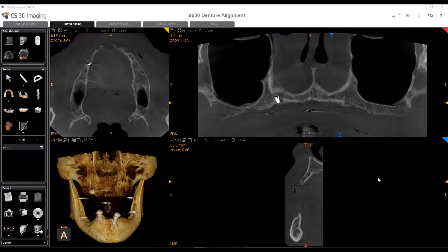Hey, what's going on everybody? This is Phil Weinberger. I wanted to show another way you can do a dual scan protocol using the CareStream CBCTs.